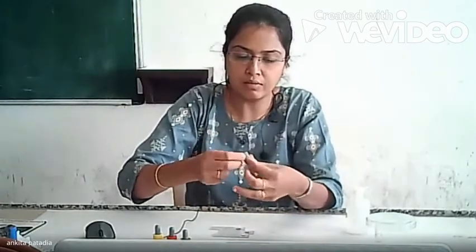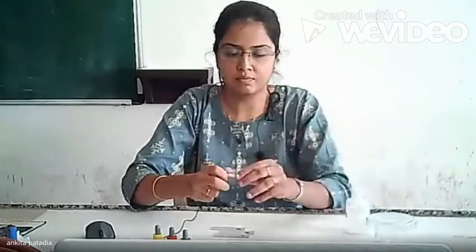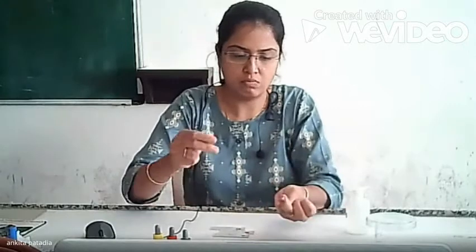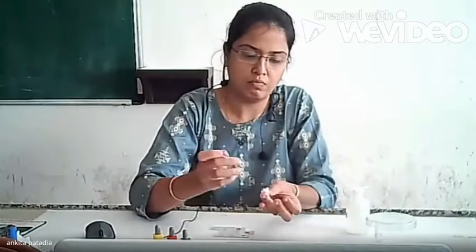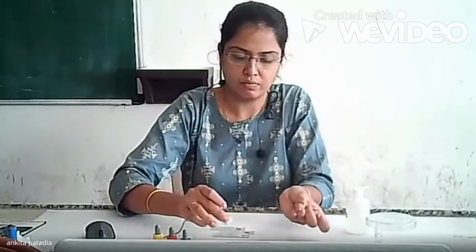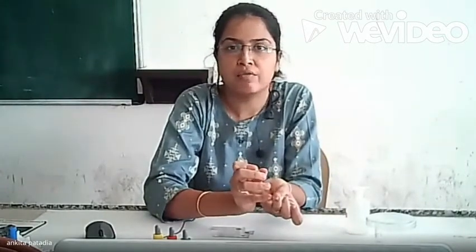Now open the needle. Once again we are cleaning it. Just 30 seconds you have to wait for drying.